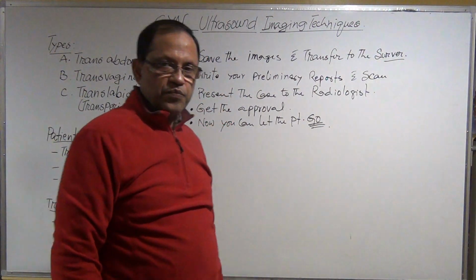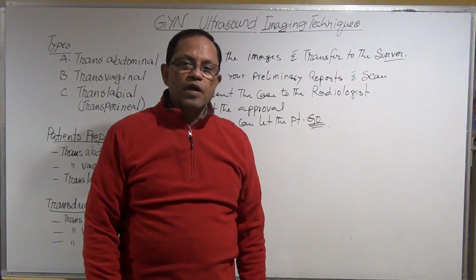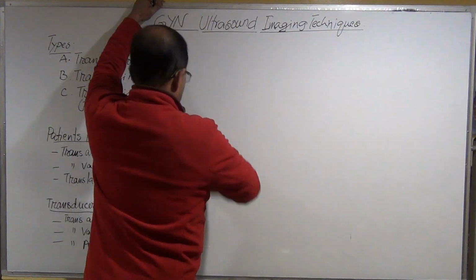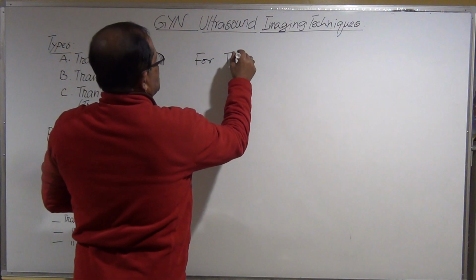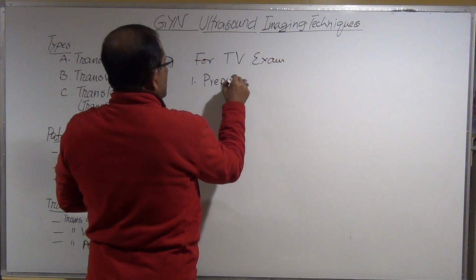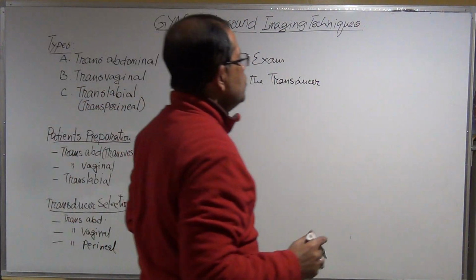Now come to this point. For transvaginal examination, you need to prepare the transducer. But how does it look, the transducer?